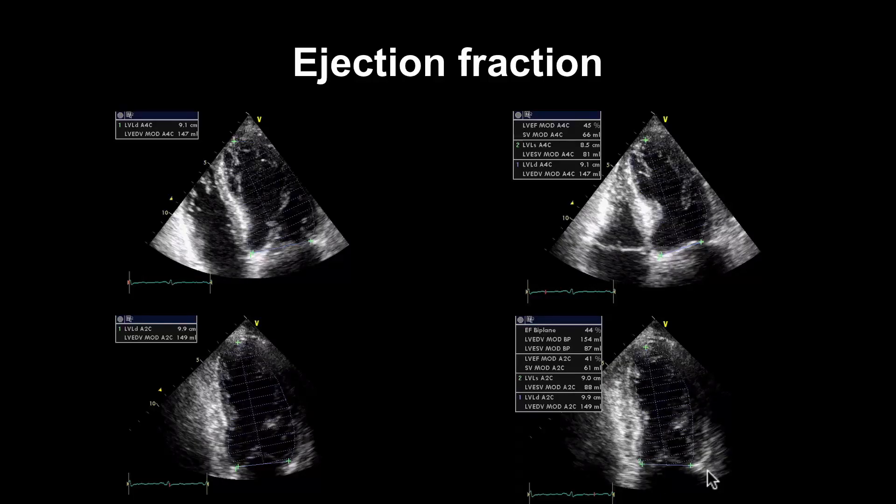We usually assess the function of the left ventricle using the ejection fraction, which is exactly what it says. It's the amount of blood ejected from the left ventricle, expressed as a percentage of its maximum volume. It's normally around 60%, but in a severely impaired ventricle it could be 30% or less.